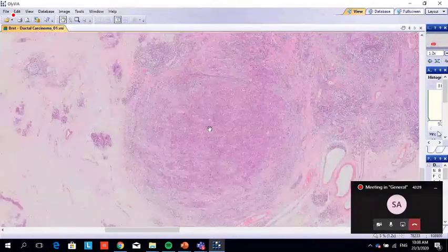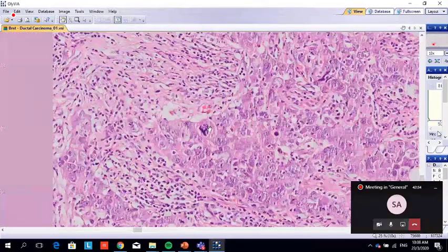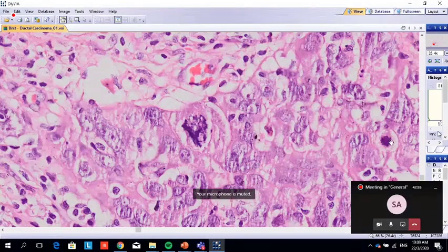How to grade? What do you think this one is? Which grade? Look at this. This one is what? Mitosis. This one, I think, is tripolar. We can give it 3. This one, look at this. Also mitosis, like a star shape. Doctor, the ones with very darkly stained chromatin are basically the mitosis? These are the nuclei in mitotic phase, but abnormal mitosis.